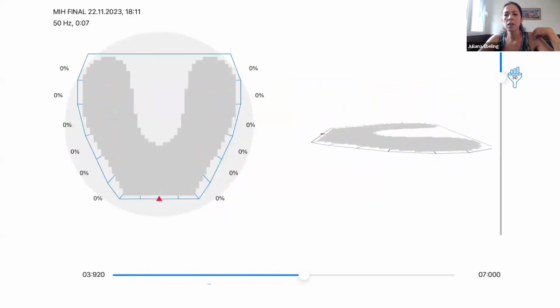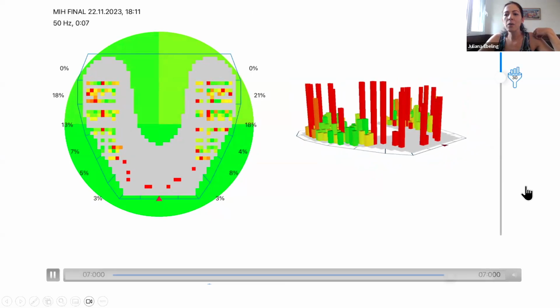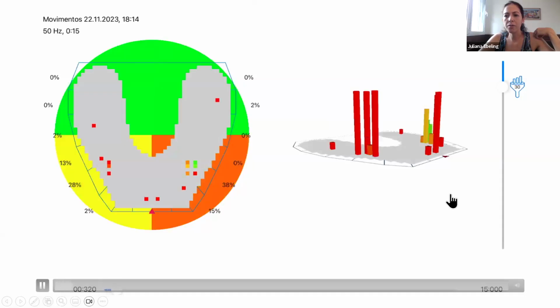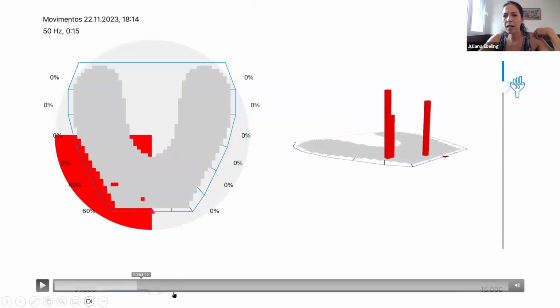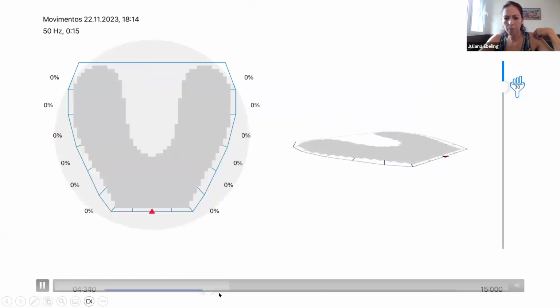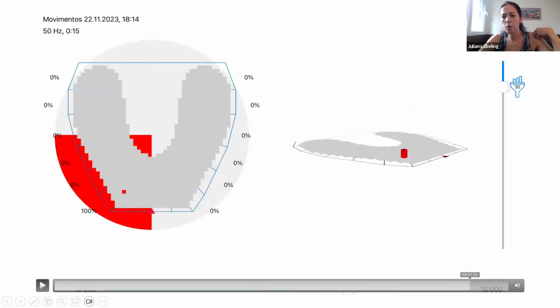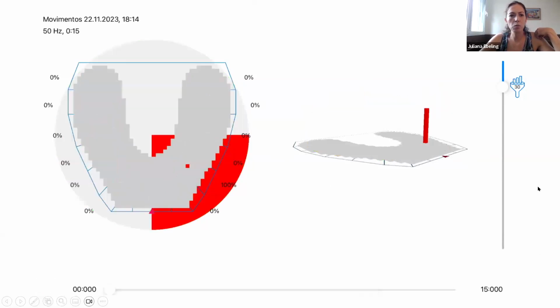It's a happiness to see that when we can get this result with a lot of effort from the whole team, and we have the movements with canine guidance, canine to canine, and forward movement, and a very stable posterior occlusal contact distribution.